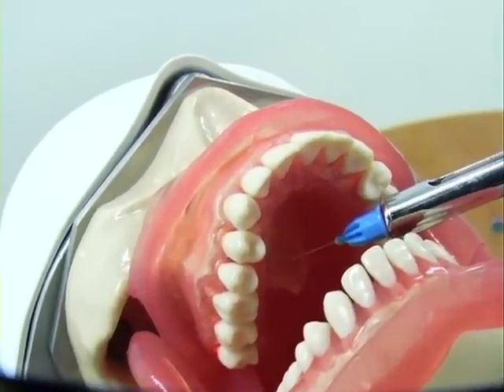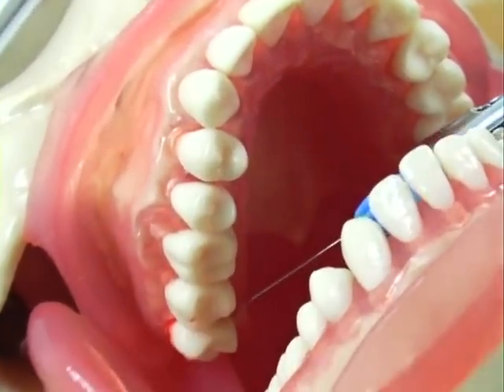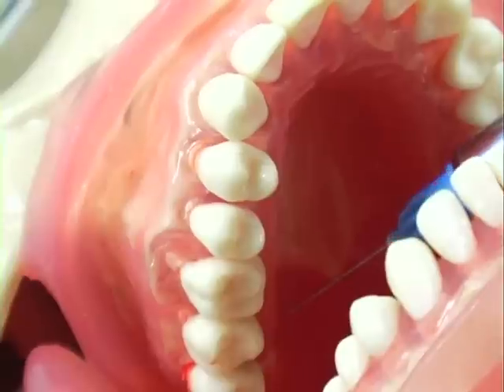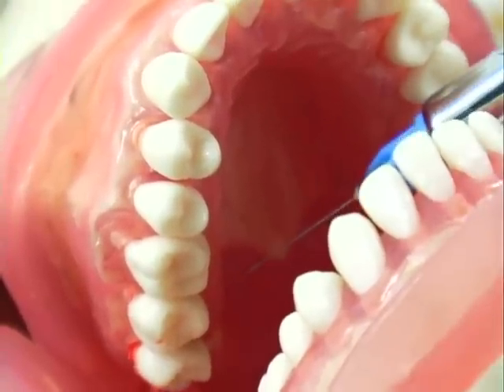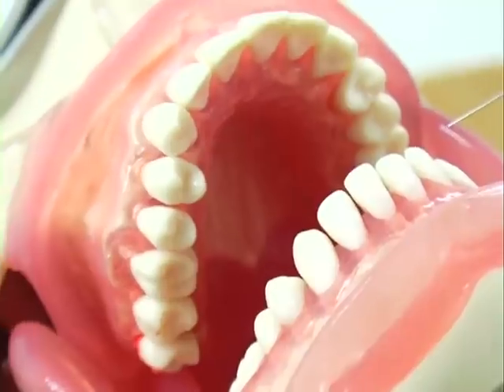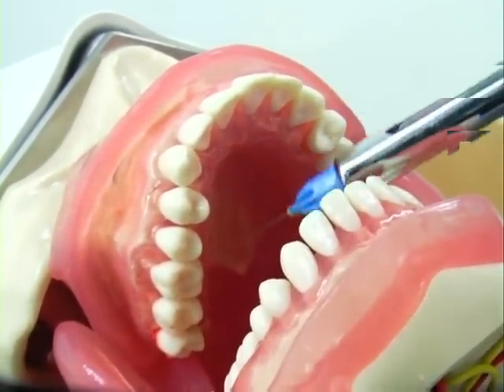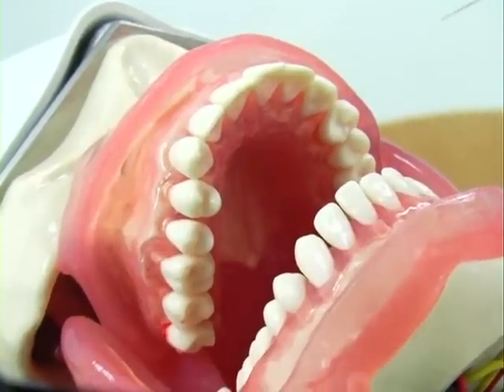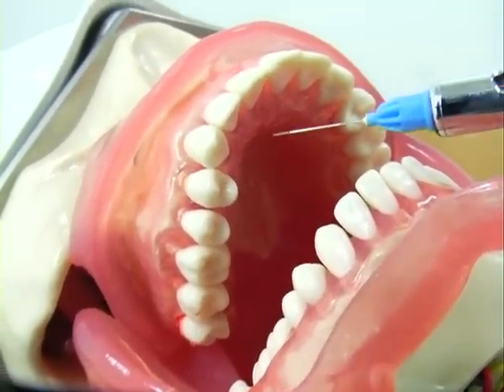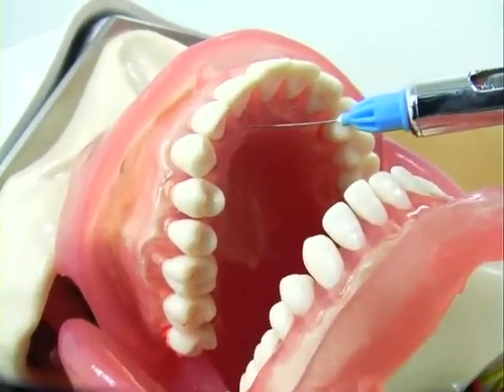Usually you will find lots of adipose tissue here to make your injection comfortable. This is the area where you should block the greater palatine nerve. As mentioned earlier, you should not go beyond the distal surface of the seven, as anesthesia of the lesser palatine nerve can occur and can cause gagging. Try to remain anterior to the distal surface of the seven.